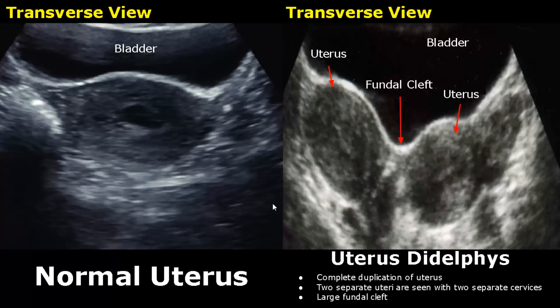These are transabdominal images of the uterus. On the left side is a transverse image of a normal uterus. We can see the normal myometrium and normal endometrial canal. This is the bladder anterior to the uterus.